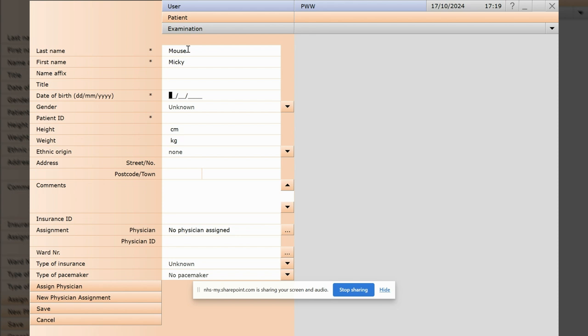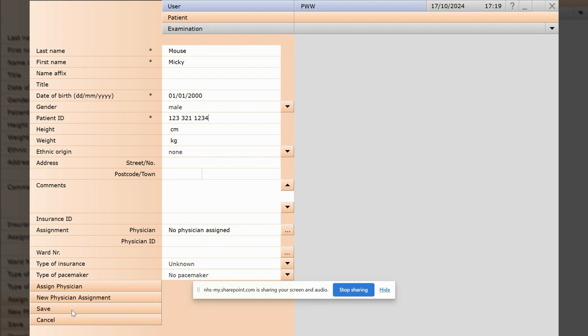The ones within asterisks are required, and the patient ID should be their NHS number. Once you're happy with that, hit save down there at the bottom left.